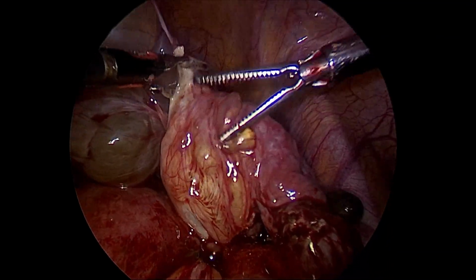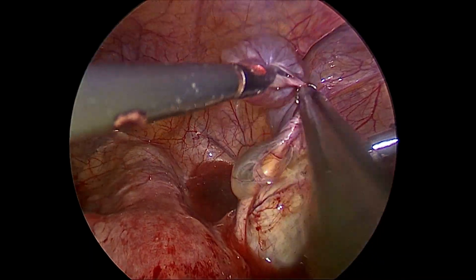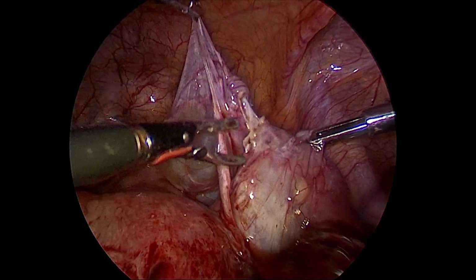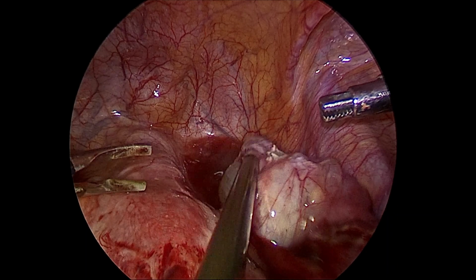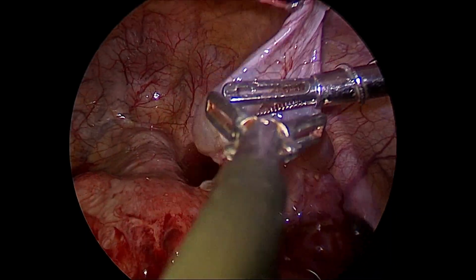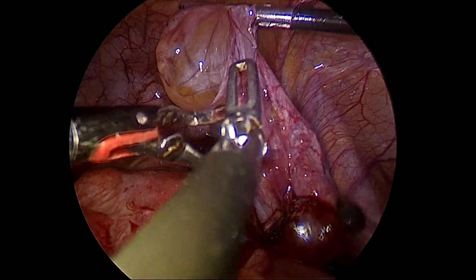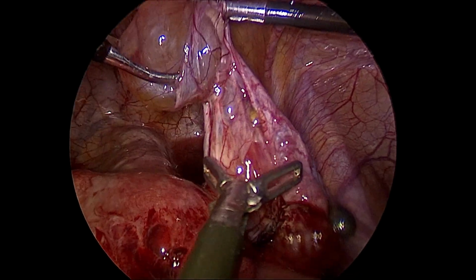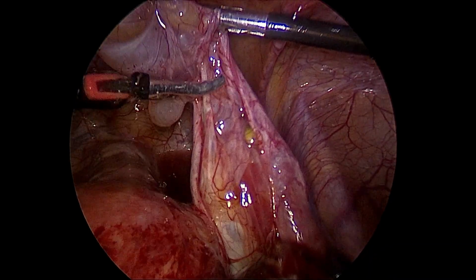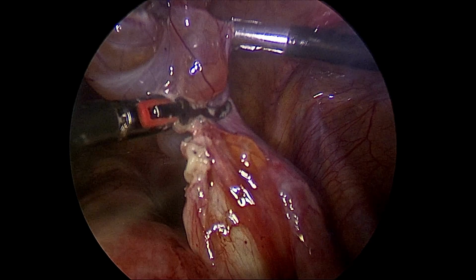These are the peritoneal inclusion cysts that we detected on ultrasound. As you can see, this looks like a bunch of grapes, and in a woman with endometriosis there will be a classical picture on ultrasound. Whenever this picture is there, be sure that it is going to be minimum stage 3 to stage 4 endometriosis. So these are just held with a grasper and we drain off the fluid to make it easier to handle, and after that these cysts are just dissected out and cut with the bipolar shearer.